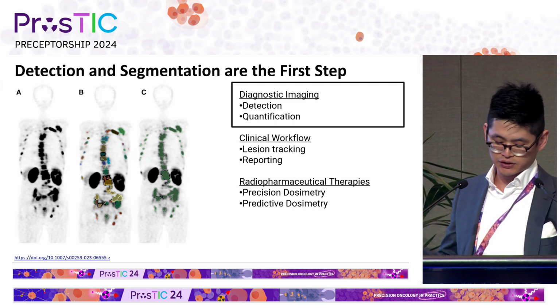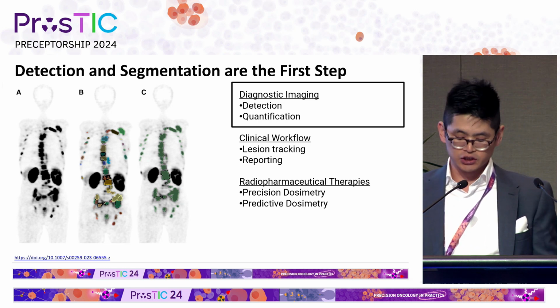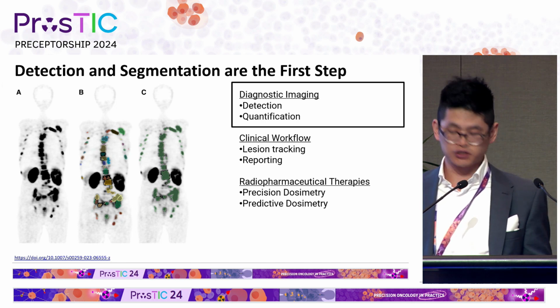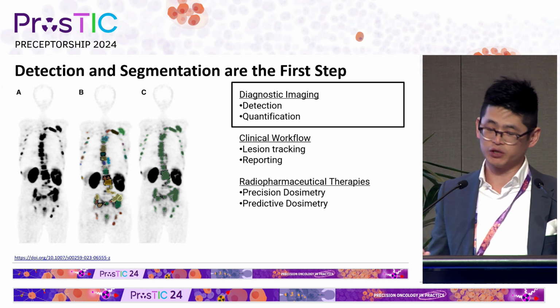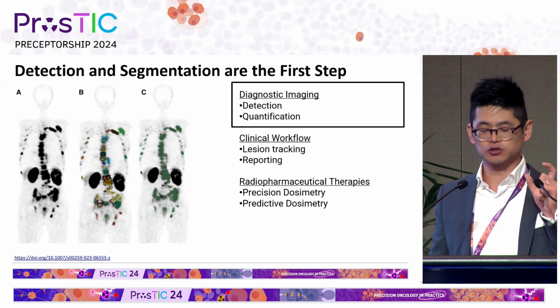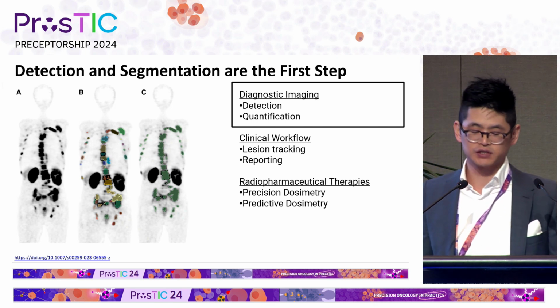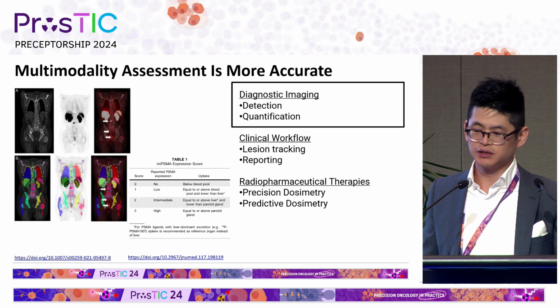AI was trained on this study, and then to assess performance, they looked at the patient level, then the lesion level, and finally at the voxel level. And they were getting patient level accuracy of around 83%, lesion level detection with F1 scores around 93 to 97%, but at the voxel level, they're only getting the DICE coefficient scores around 65 to 70%. So really that segmentation is still a challenge.